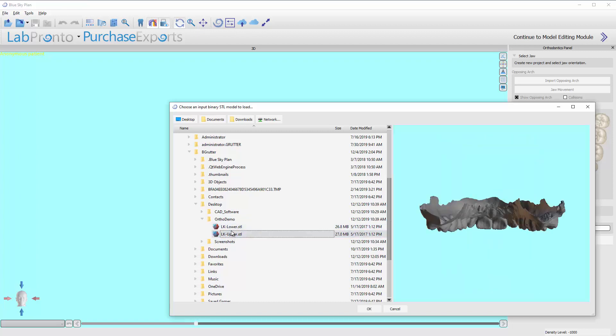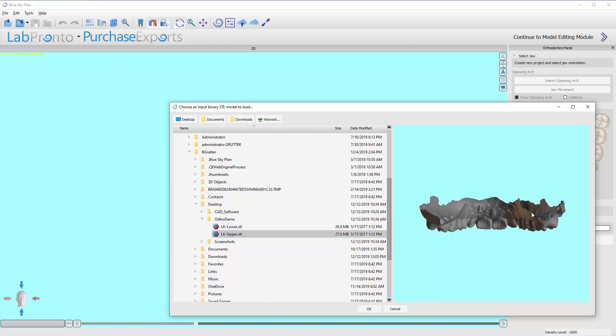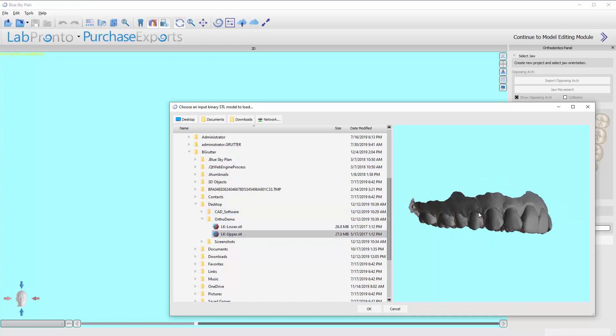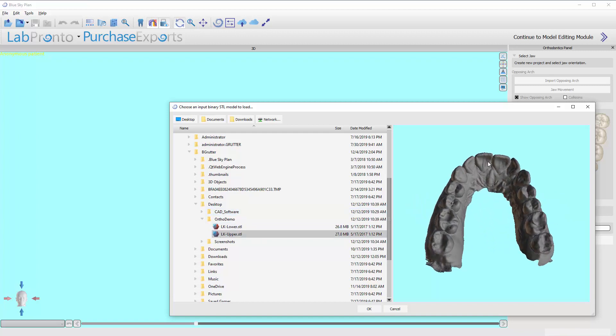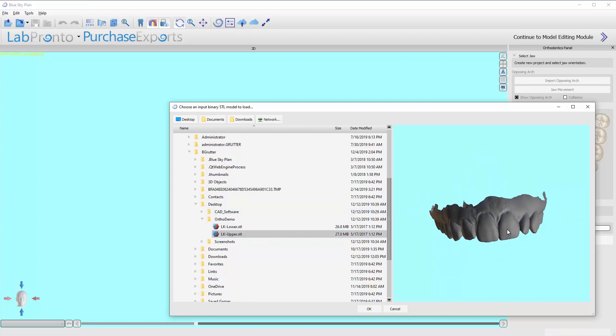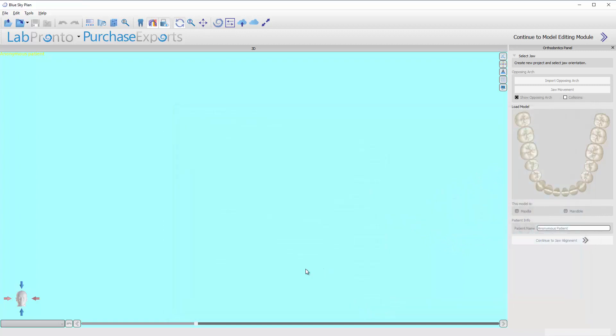You can pick whichever one you want, upper or lower, and you can even use this viewing window over here to confirm this is the model you met. Okay, click on OK, and it's going to ask us is this the maxilla or the mandible. We want to make sure we select what's appropriate of course.